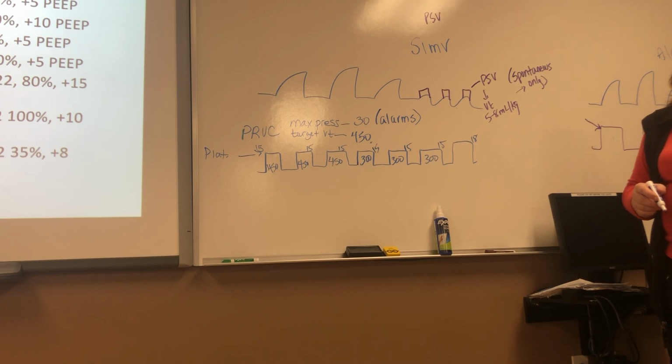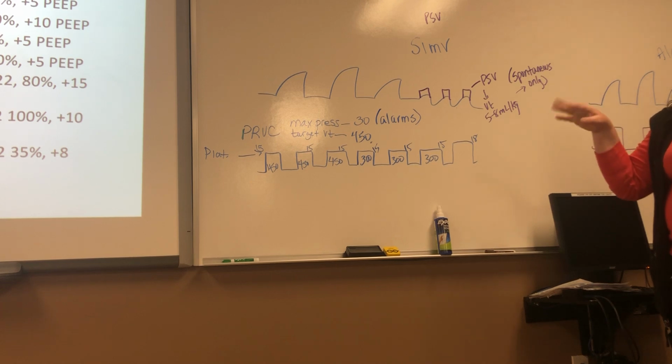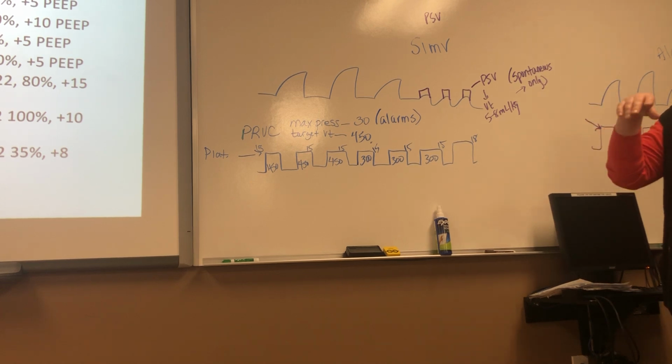Haley? So what kind of patients would you see on PRVC? PRVC is good for your normal everyday patient that doesn't have a lot of compliance and resistance problems. So if you get a lot of compliance and resistance problems, we're going to talk about being in pressure control and some other things.